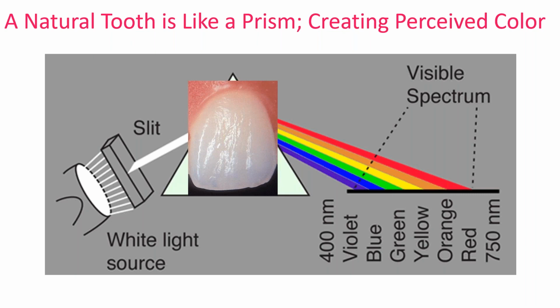It's no more or different than a prism. Light goes through them, the light refracts, it reflects, and we visually see the spectrum of light which comes back and is observable. So we want to use a white light source, right? 5500, 6500 Kelvin type light. We want it as true lighting conditions as possible. And this is for the room itself.